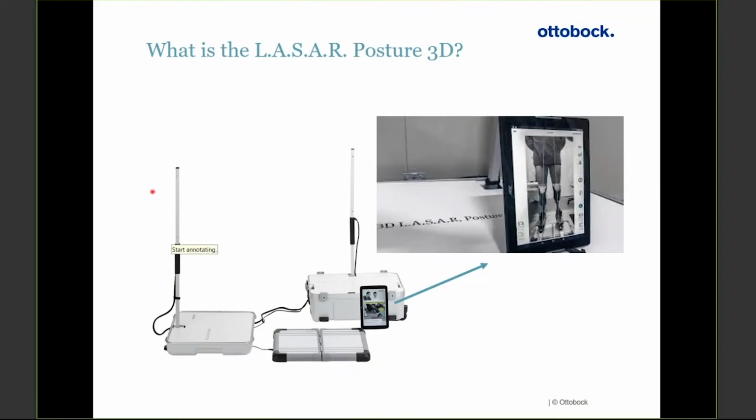We also have 2 camera stands. These poles here are actually sets of cameras. If you can see, there are some very, very small little circles in these camera poles here. They are the cameras, facing in this respect the coronal plane camera, and here we have the sagittal plane camera.